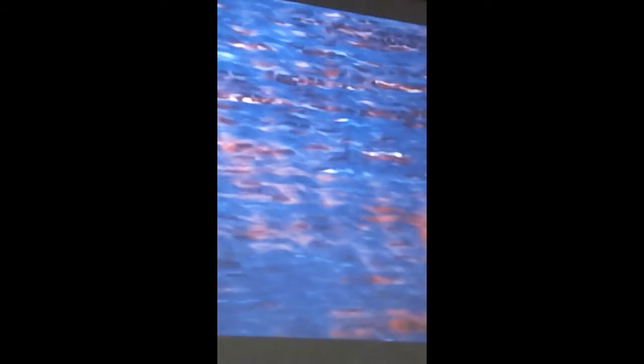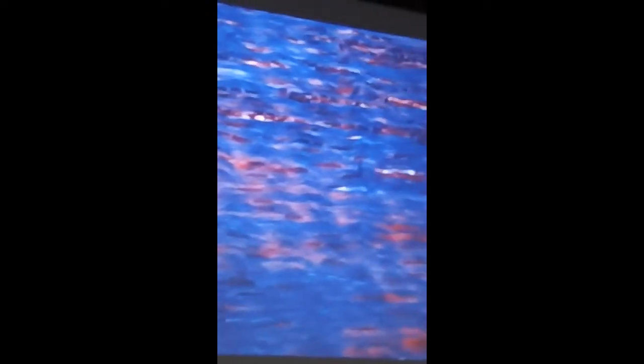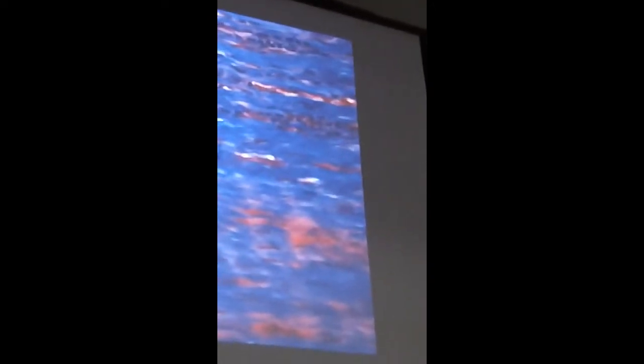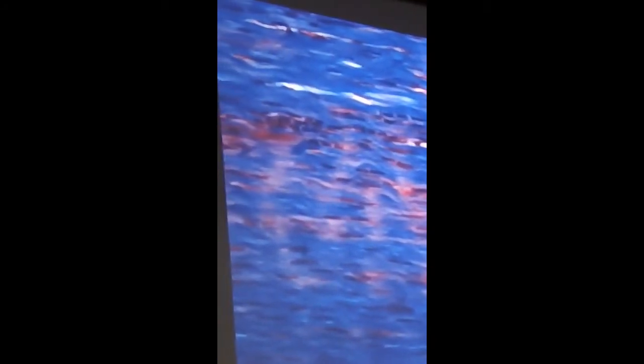If we do a Mallory trichrome, where you see that brilliant blue is technically correct. Where you see the bits of red is a technical failure. Right? So at any rate, it's clear that a Mallory trichrome identifies collagen. You may have trouble in an H&E section distinguishing collagen from smooth muscle. One way that you could get around that is to use a trichrome.